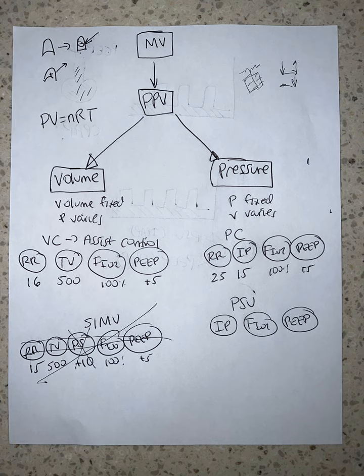Okay. So there was a question about weaning. Many times, typically, weaning is used in pressure support because it's totally spontaneous, and then you just dial down.